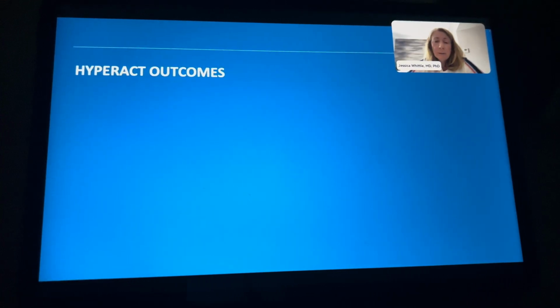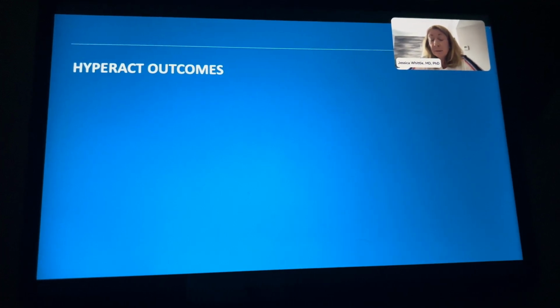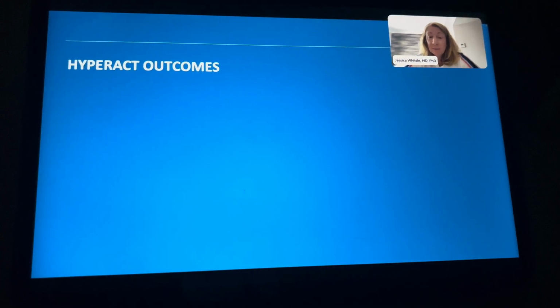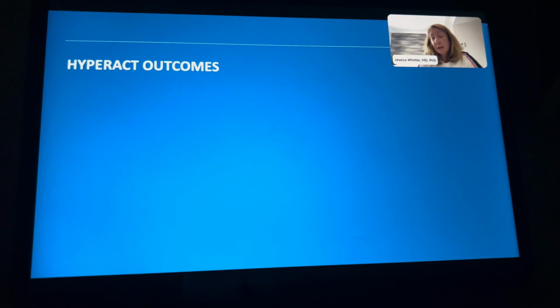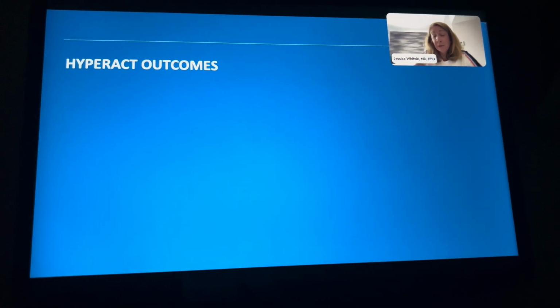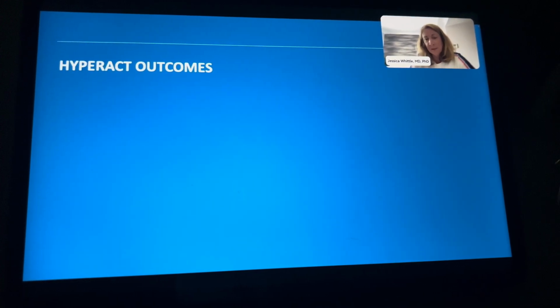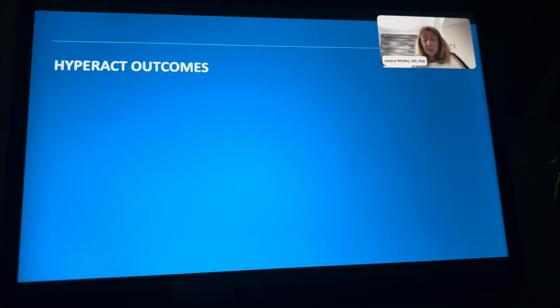Well, I think there's a growing body of evidence around the world that indicates some measure of hypercapnia can be treated through high-flow nasal cannulas in general. The investigators were most concerned because we were wanting to enroll very severely hypercapnic patients. So it wasn't the idea in general, but the magnitude that we were suggesting. But our preliminary data suggested that with a small bore system, it was possible.